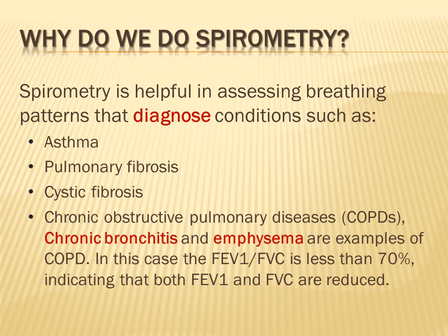And when these values are lowered, this simply indicates that both the forced expiratory volume in the first second and the forced vital capacity are reduced in chronic obstructive pulmonary diseases. We will discuss it soon in the other slides.